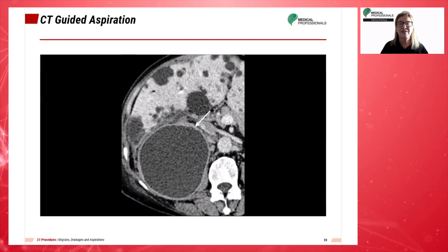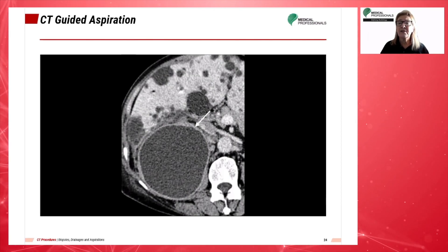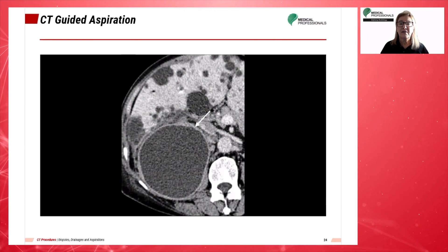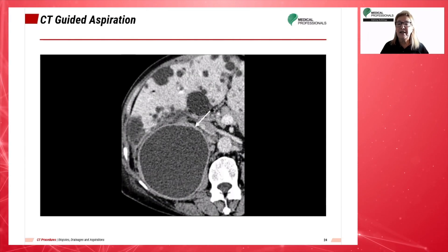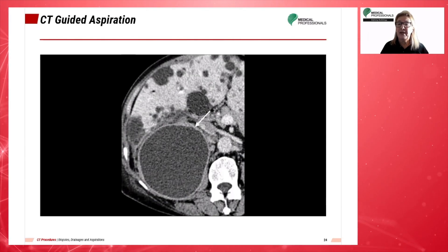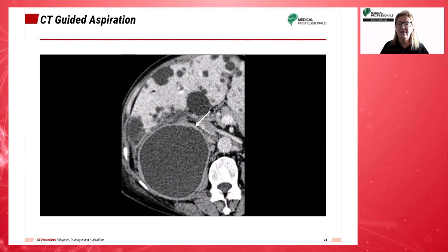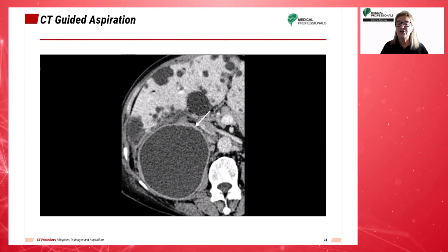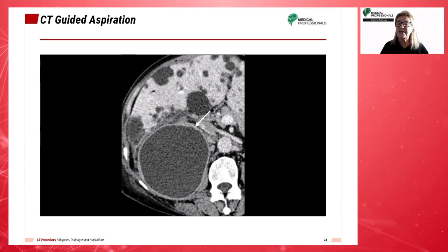A diagnosis of cyst infection is confirmed by extracting cyst fluid from the suspected cyst to help identify the microorganism or inflammatory findings. This study was on a 65-year-old female patient with an infected cyst. The pre-contrast CT image showed a 9.7-centimeter round cyst that has higher attenuation than the surrounding cysts in the right kidney upper pole, as seen by the arrow.